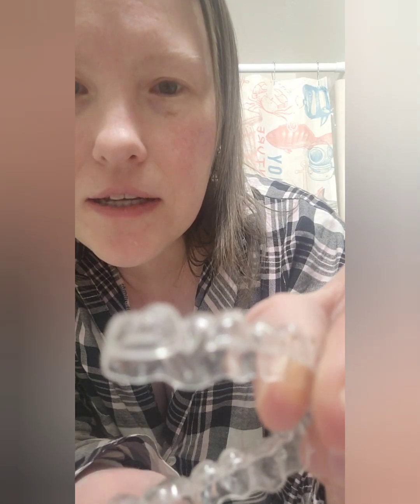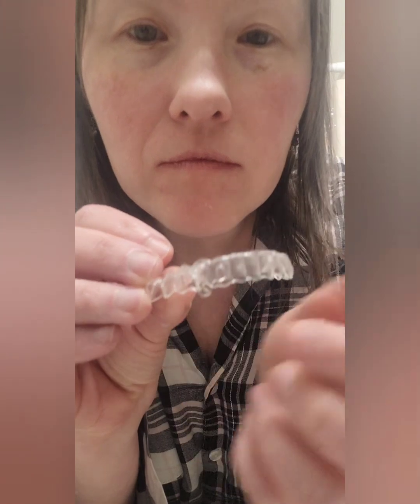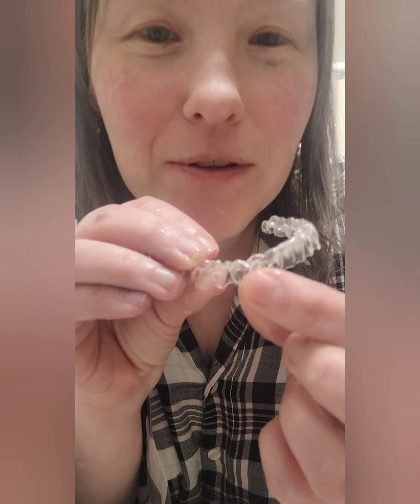You can kind of see it — so that's the top. And then the bottom, it's like the bottom two canines is where it'll hook on to. Yes, you can see them — that's where it will hook on.